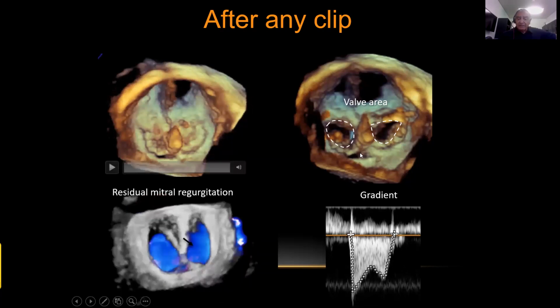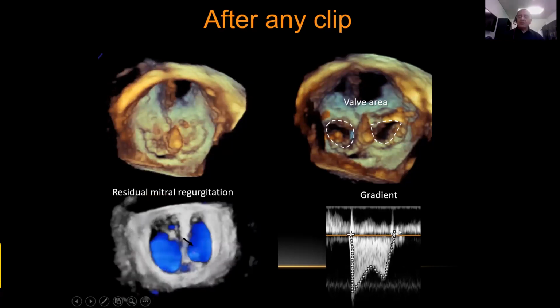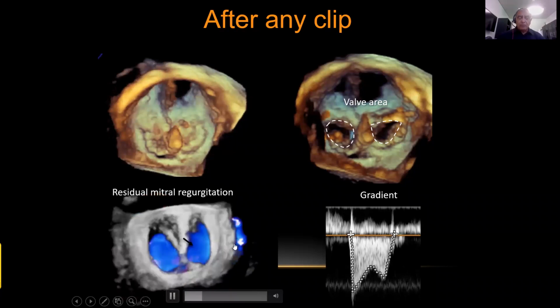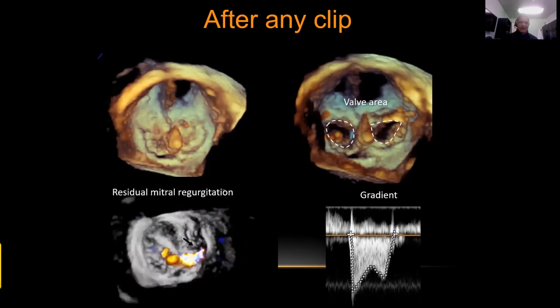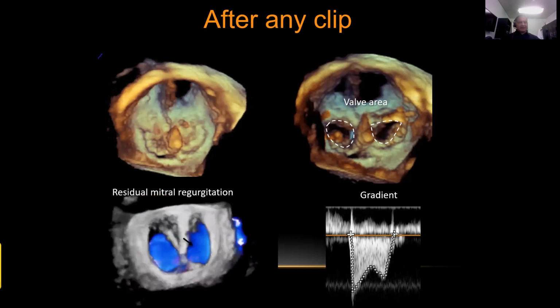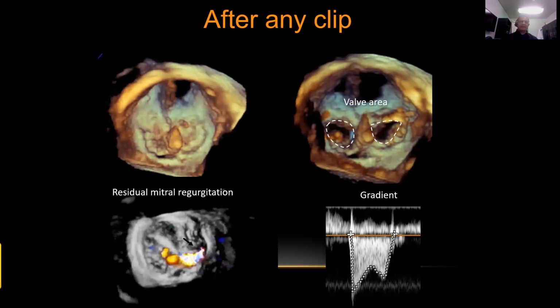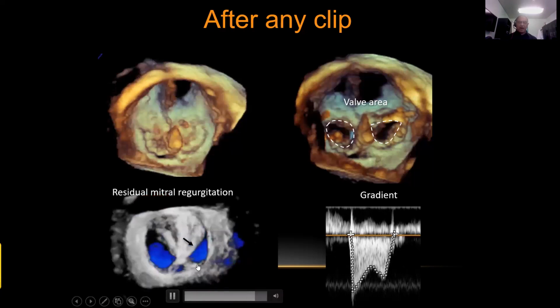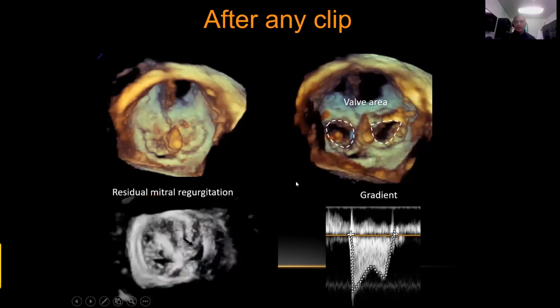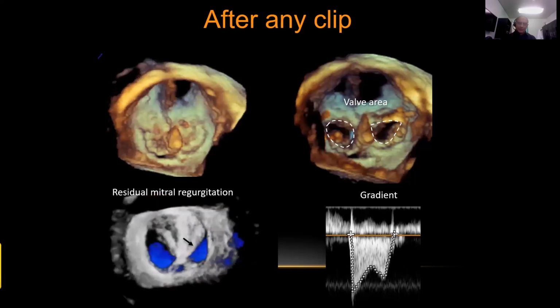Moreover, we can have the gradient. If you have an area of more than 2 square centimeters and a gradient of less than 5 millimeters of mercury, this is a good result. But there is the residual mitral regurgitation, and this is the point. There are some interventionalists, one of them Francesco Maisano, a very close friend of mine, and other Dutch friends, who want to be precise. They want no regurgitation to occur after the position of the clip. This is a good intention. I like this, but we have to face the other possibilities.